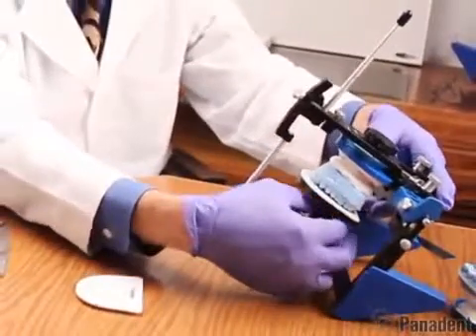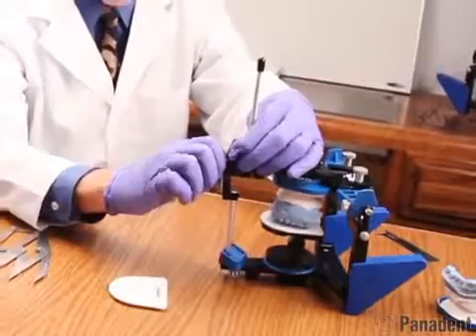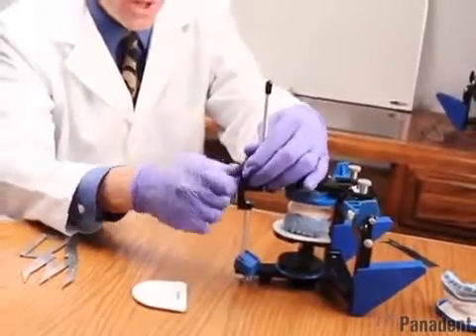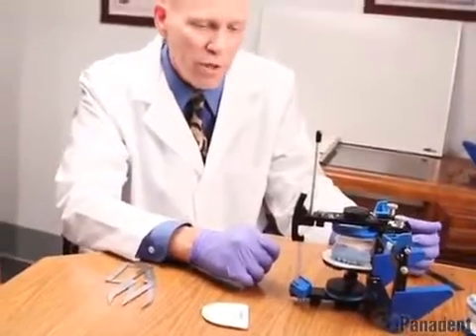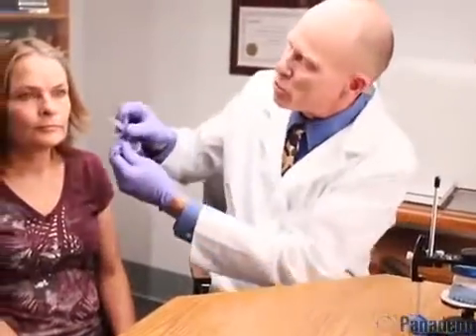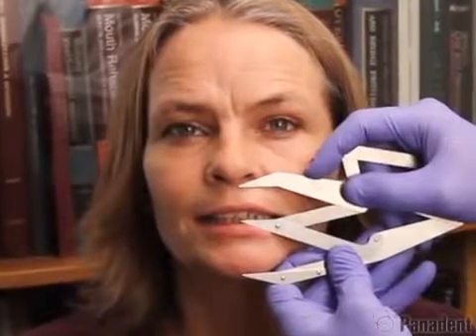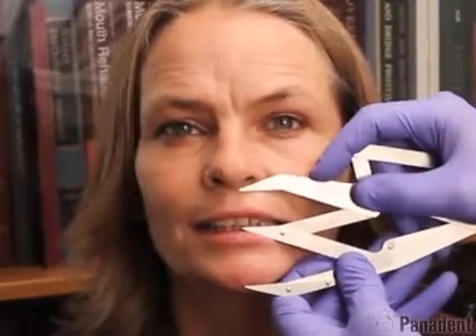Otherwise, you can just evaluate the cant of the occlusal plane in relationship to the horizontal table and just raise the buccal cusp up from the waxing guide, creating a curve of Spee or slight plane of occlusion. We can also evaluate vertical dimension of occlusion by indexing under the nose, and smile just a little bit, to the new length of the central incisor, and we can see that her vertical dimension is approximately correct, so we may not want to change that.